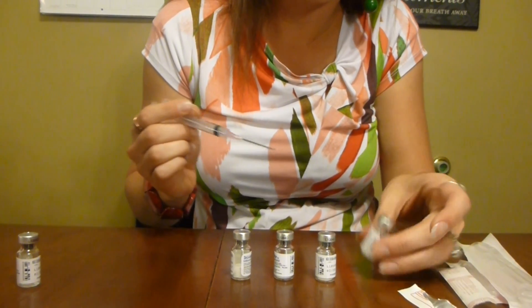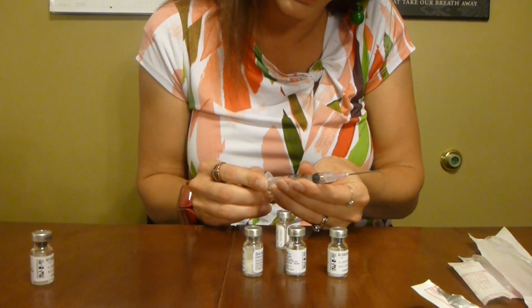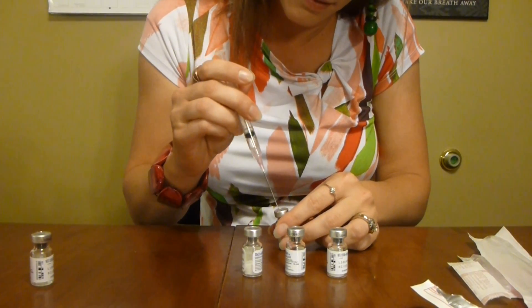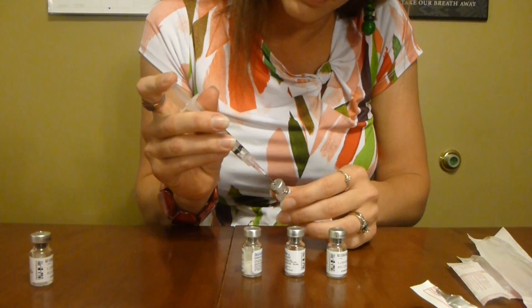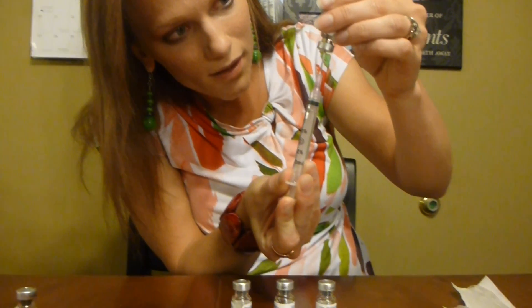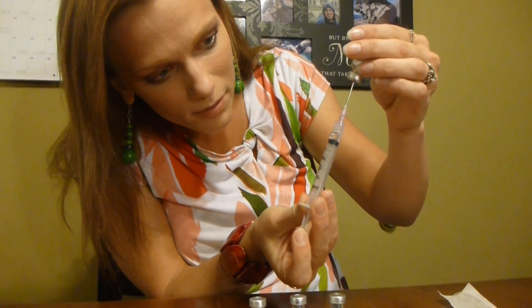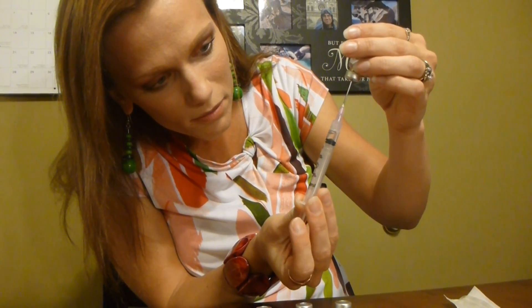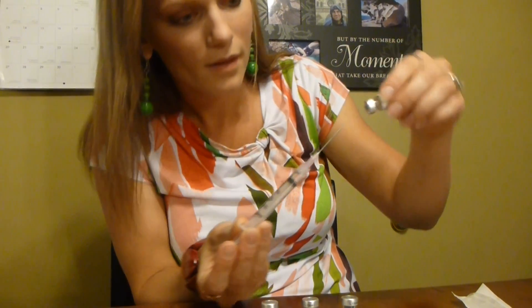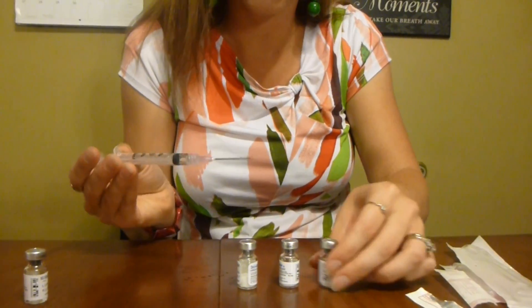Now I'm going to use my saline solution. Same thing — I need to draw a little bit of air in here, put the air in, turn it upside down. It's kind of a complicated process, really. I want about another half milliliter. Done with that, no more saline solution.